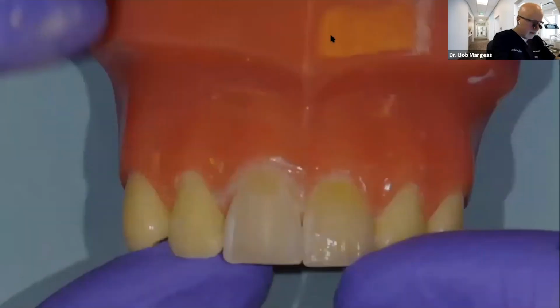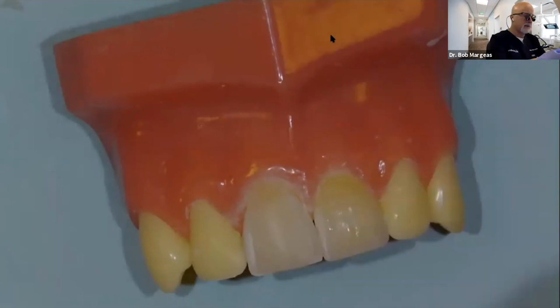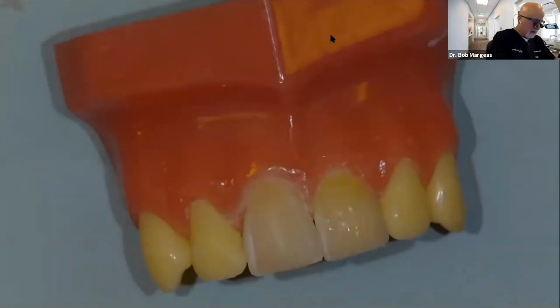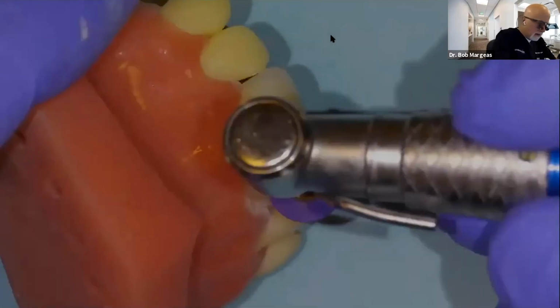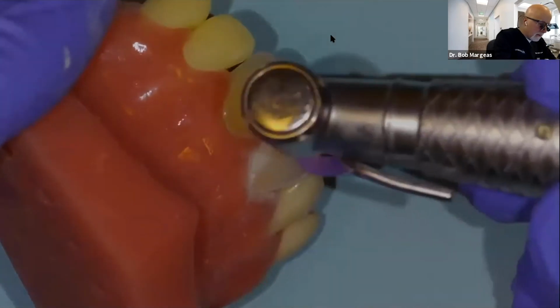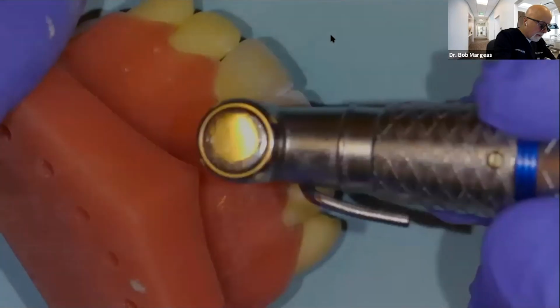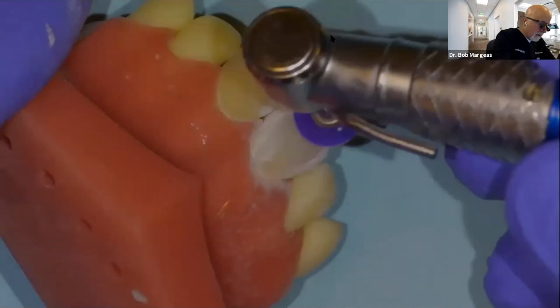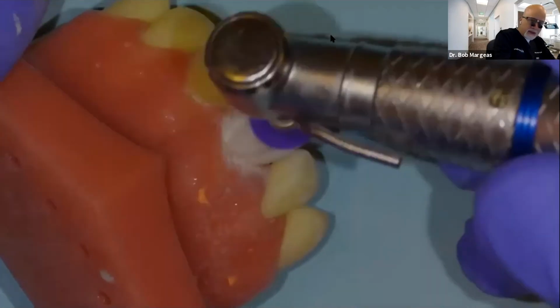Now what I'm going to do is go to the smaller contours because I like to get this into the interproximal. Like this. I'm going to take this disc and go into the interproximal and narrow this. Thin that out.